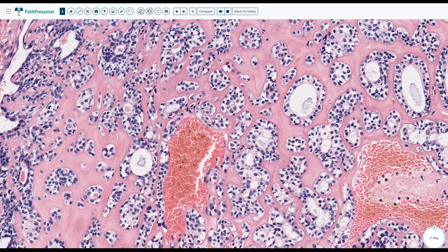I usually describe the myoepithelial cells like a kid who was drawing and then got the rubber and would like to wipe that drawing. So it will be like something that has been a little bit wiped. It's not clear, it's like watercolor, it's not something shiny. That is usually the myoepithelial cells when you see them.